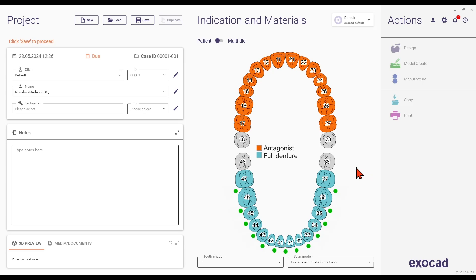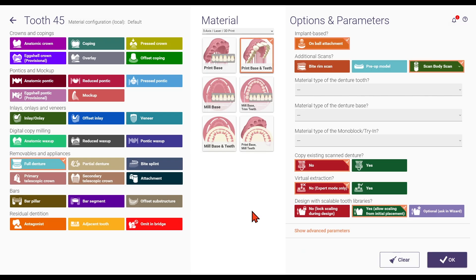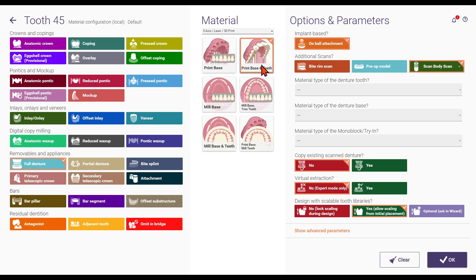In the material configuration section under removable prosthetics and appliances, choose the full denture configuration. Select your preferred manufacturing workflow for the restoration. In the implant-based section, select the on-ball attachment configuration.